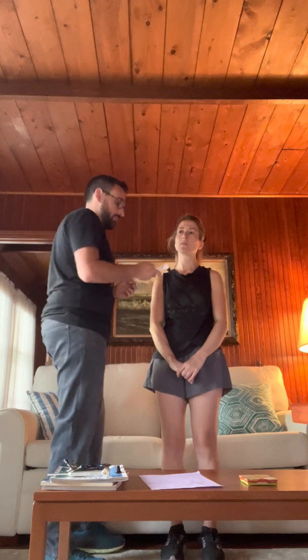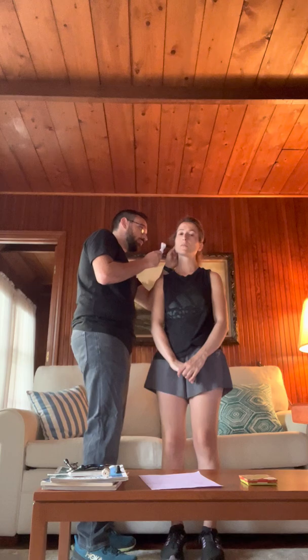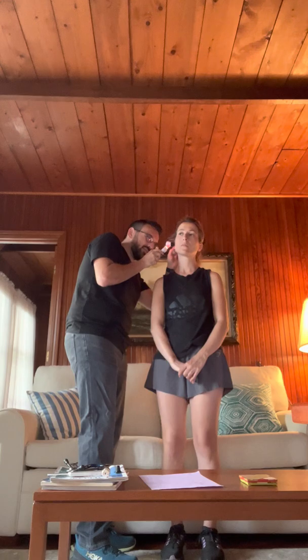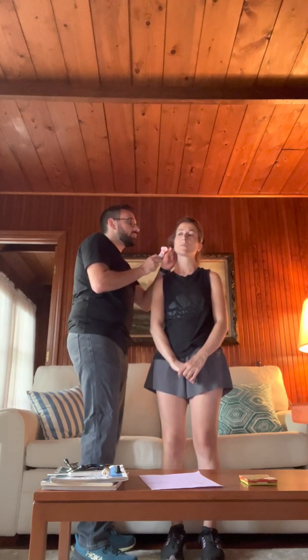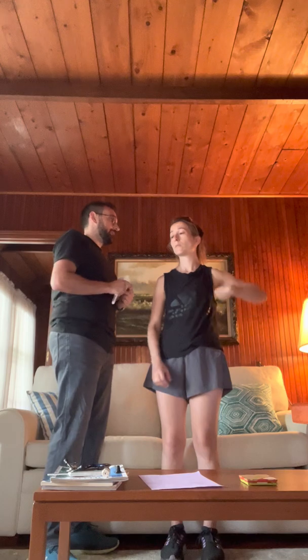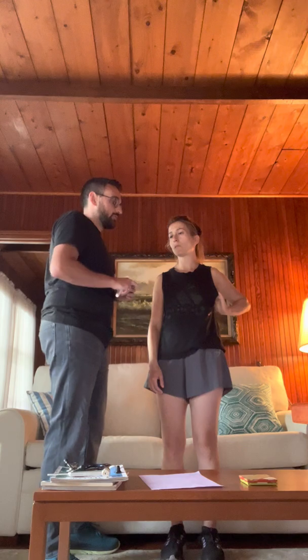So now we're going to assess it internally. So I'm just going to pull back a little bit. Okay, so now we check the tympanic membrane. It's intact. There's no cerumen, no discharge, no redness, no swelling. So I'm going to do the same thing for the other ear. So I'm going to go to the other side.